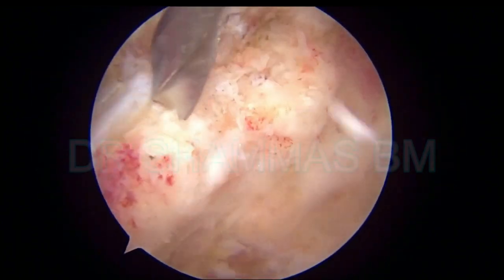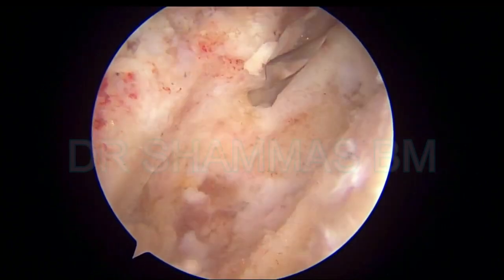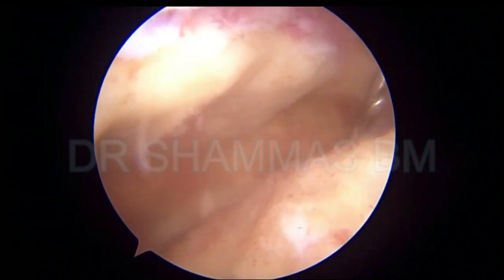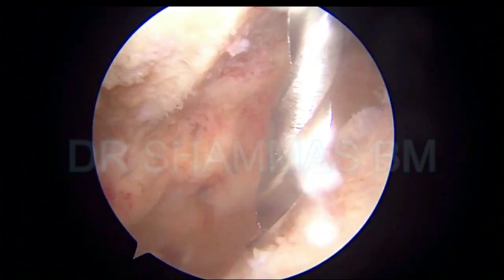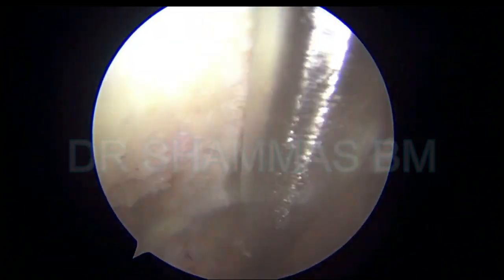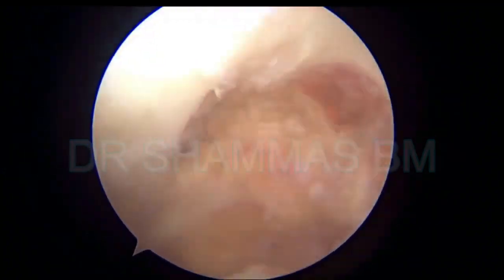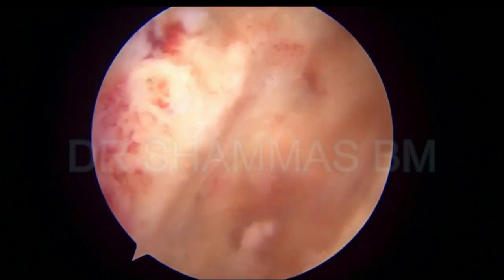You cannot get access at 90 degrees to the bone — you can go only in an oblique manner — but whatever is possible, you should do some drilling in the tibia and also in the talus. From all this area the fresh blood will come in and help in fusion of the joint. This is the talus being drilled — multiple drill holes are being put in the talus. In areas where you cannot drill, you can use the chondropic to induce bleeding, both on the tibial side and the talar side.